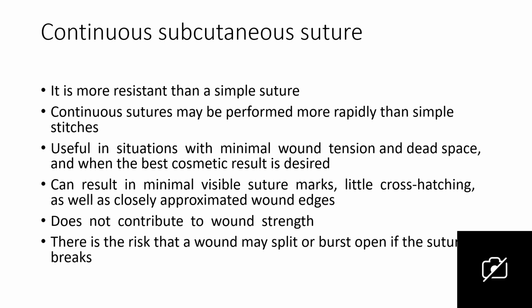Continuous subcutaneous suture is more resistant than a simple suture. Continuous sutures may be performed more rapidly than simple sutures. Useful in situations with minimal wound tension and dead space, and when the best cosmetic result is desired. So you use continuous suturing technique.